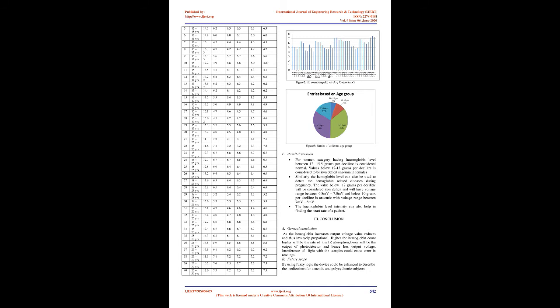B. Advantages of non-invasive techniques. Needle-free, painless testing system. Eliminates possible infections. Advantageous to hemophobic and diabetic patients. No need of expertise. Device is portable. Cost-effective. Real-time monitoring system. See description of block diagram. The block diagram is shown below for the detection. Figure 1, block diagram. D. Hardware analysis. Figure 3, entries of different age groups.